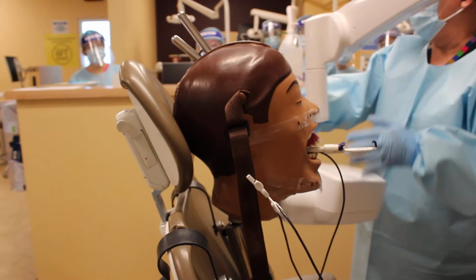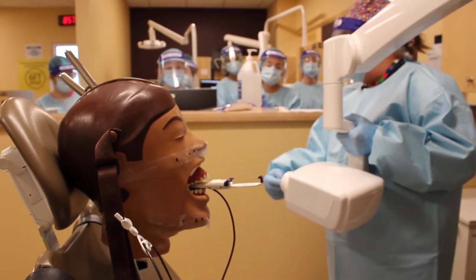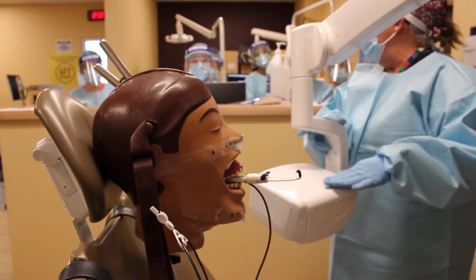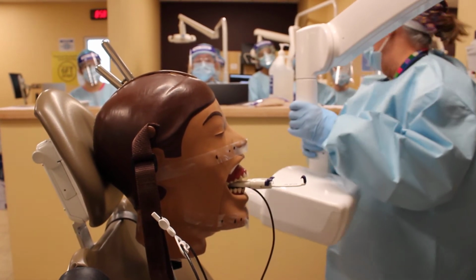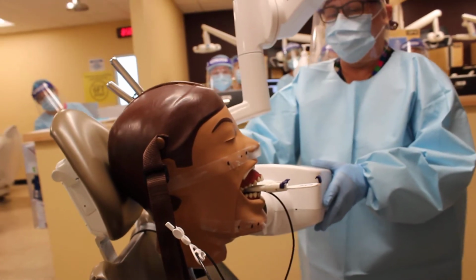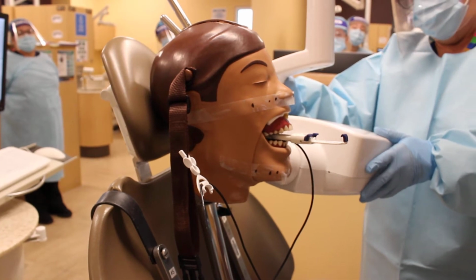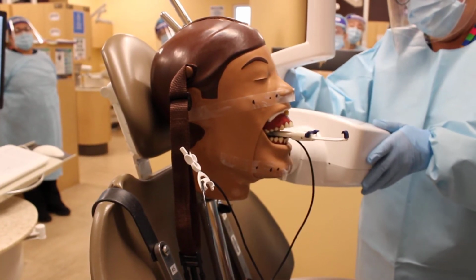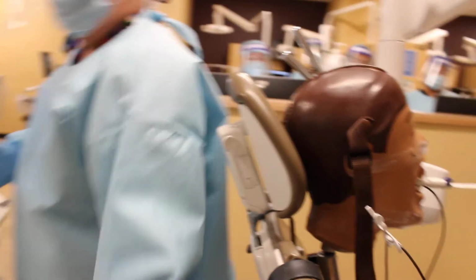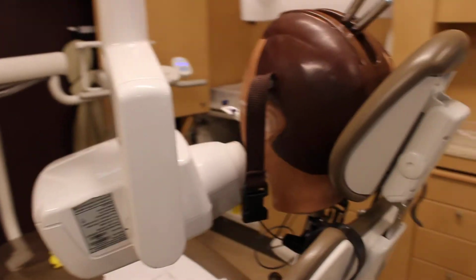My central ray, when I'm talking about central ray, it's like if there was an imaginary laser beam right in the middle. I'm putting that to the dot without changing my angulation from my cue sheet. So I'm going to go here, and my central ray is going to hit that dot. Actually, I think it should go a little further back. I've been using this Snapper for 30 years, so I love it.